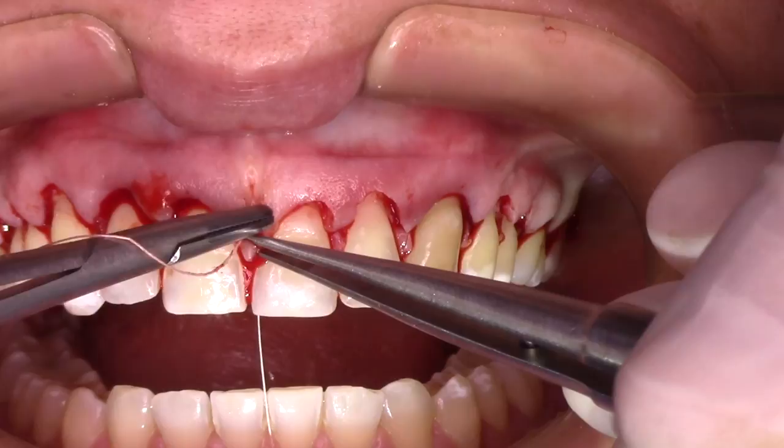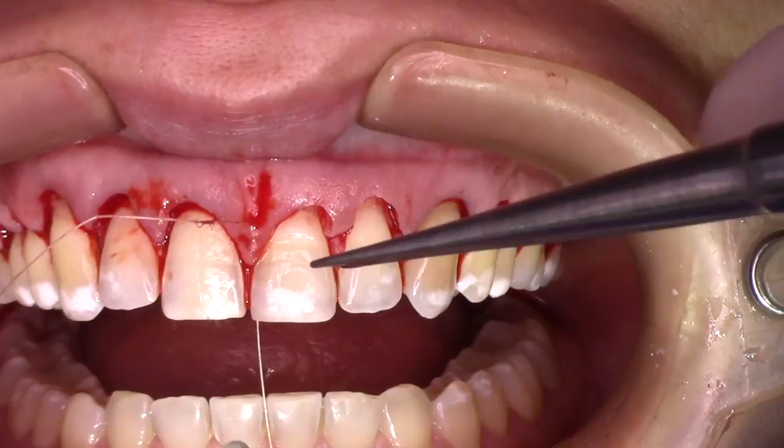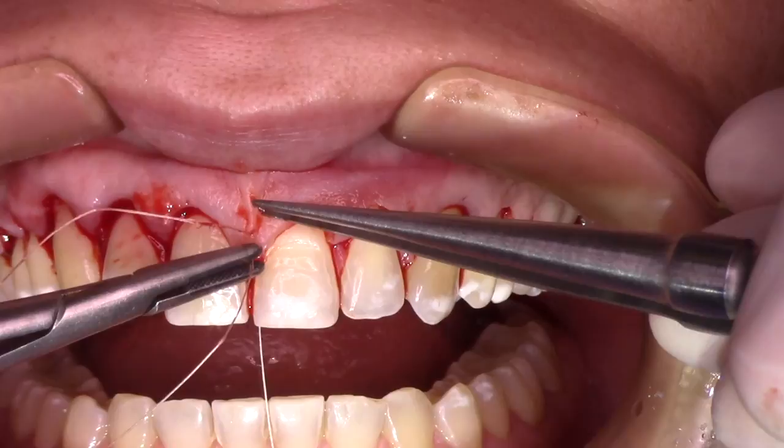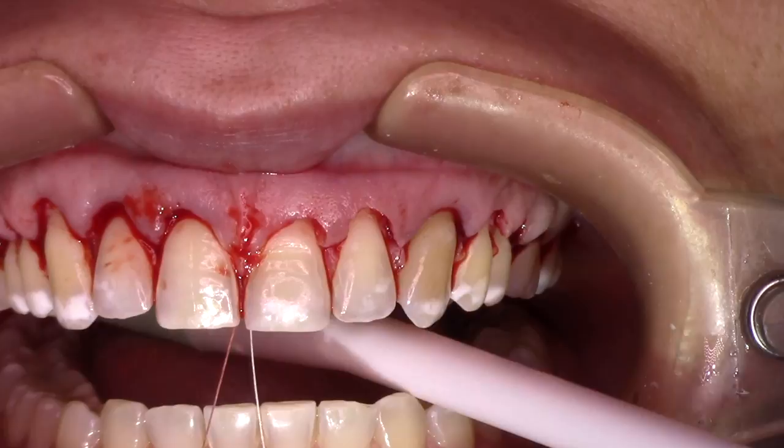We use a vertical mattress suture for this technique. The first part of the suture is responsible for providing the tension to position the flap in the right place, and the second part of the suture is responsible for properly positioning the tip of the papilla.